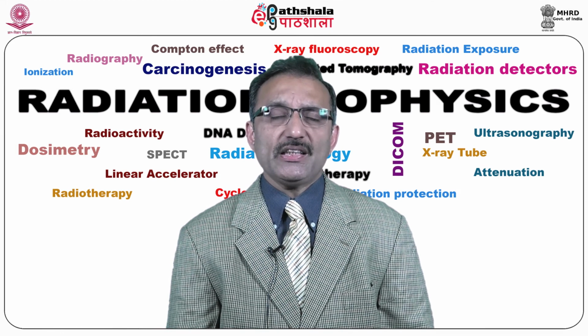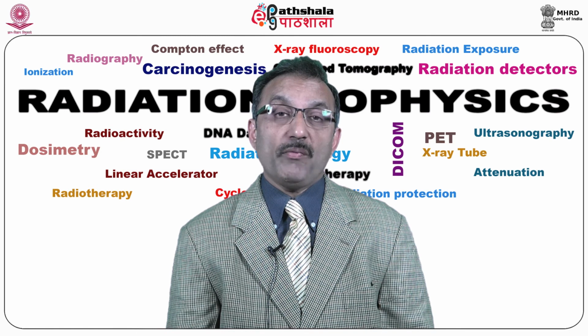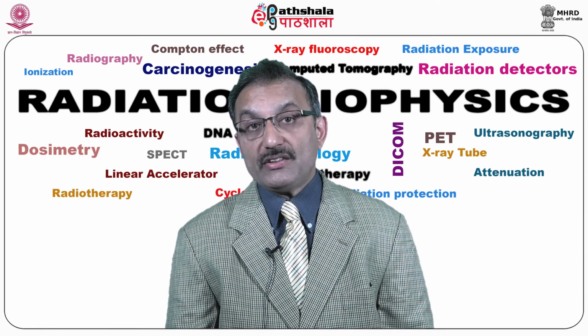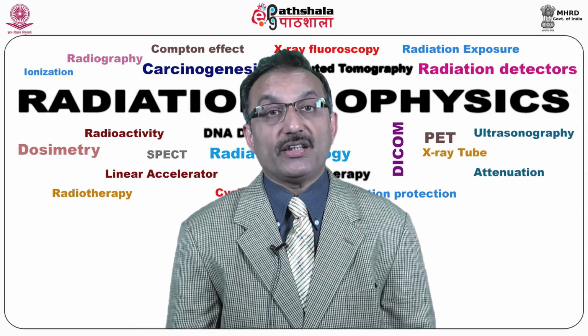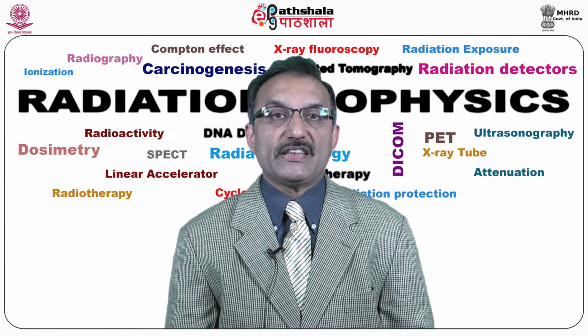So this is a very, very important point: how much activity is to be given and for how long the acquisition is to be done to get a good quality image. Our objective is that the scan should be finished in minimum time with less activity, and it should not happen that while doing so we are missing information.